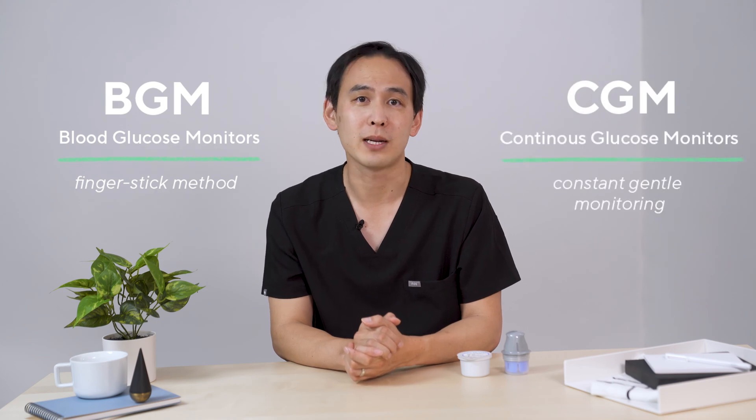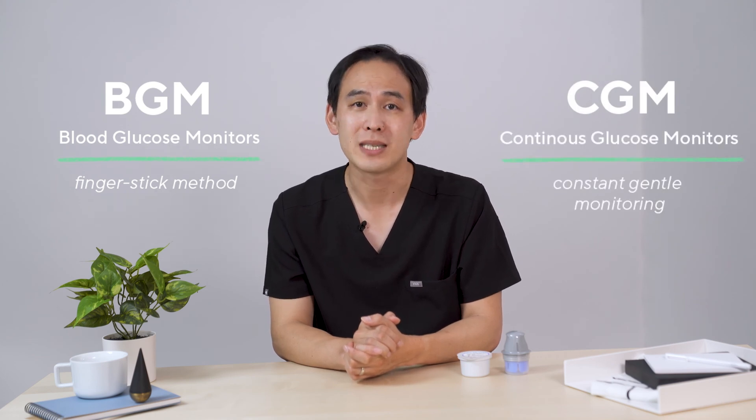While BGMs, or blood glucose monitors, are the most common method of measuring blood sugar, CGMs are increasing in popularity due to their convenience, and the more detailed information they provide helps you make the right lifestyle choices for your body.